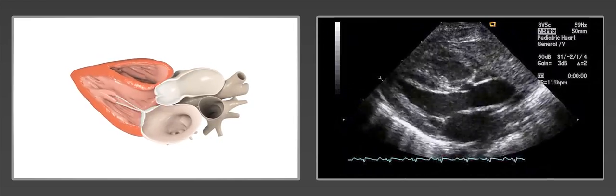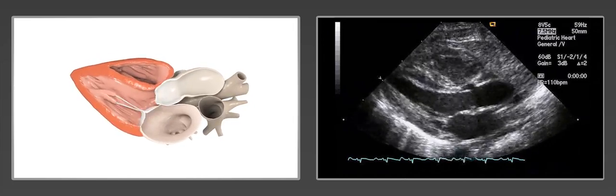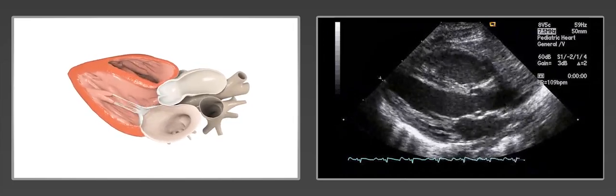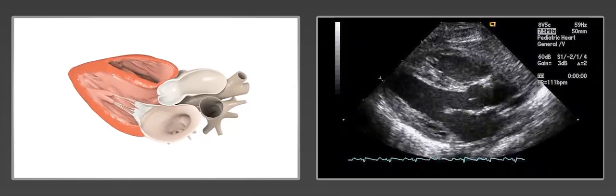Color flow Doppler can be used to evaluate mitral or aortic flow disturbance, stenosis, or regurgitation.